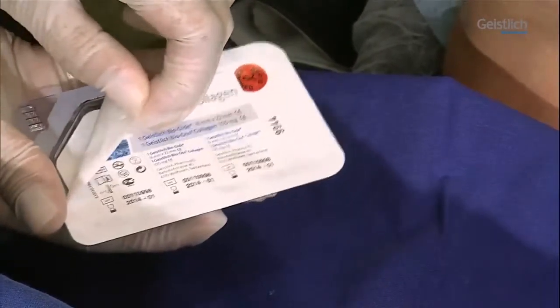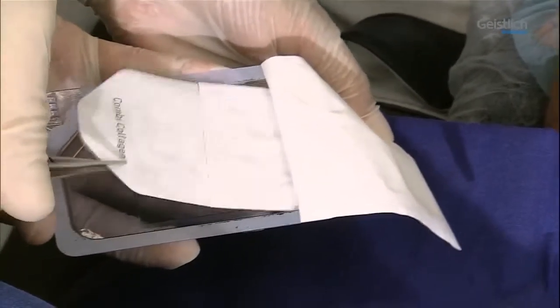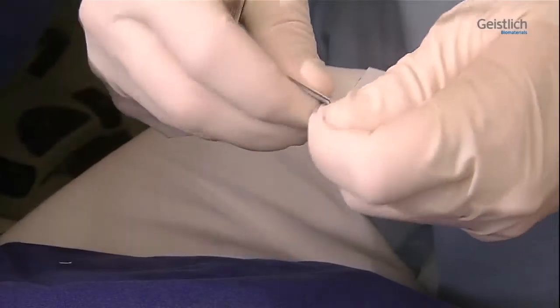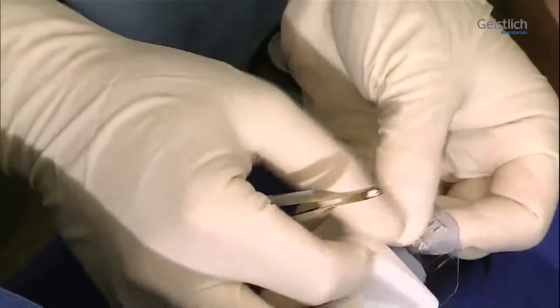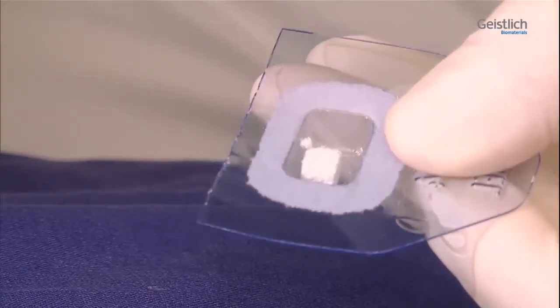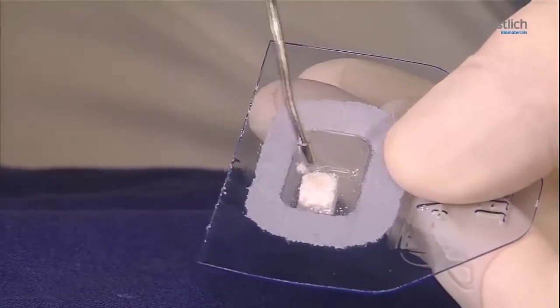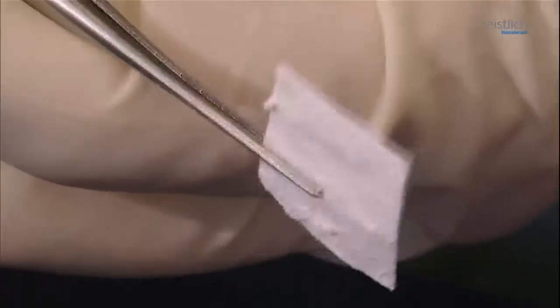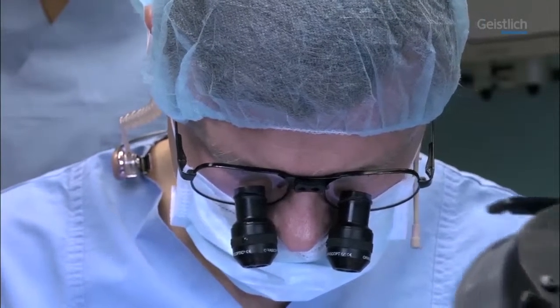The Geistlich CombiKit Collagen consists of a 16 x 22 mm Geistlich BioGuide collagen membrane and a 100 mg Geistlich BioOSS collagen block, which are individually packaged in sterile blisters. The Geistlich BioOSS collagen block absorbs liquids well. Both products should be used together in the same procedure. The collagen membrane has two sides which are differently structured. The side of the membrane facing outward after application is marked with the embossed word UP on its surface. Based on the previously made paper template, we cut the membrane to size.